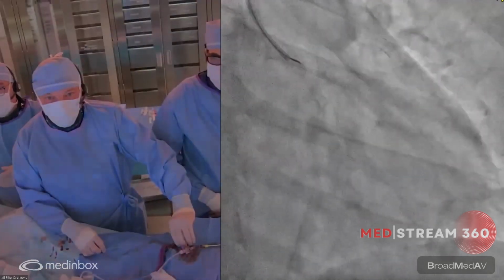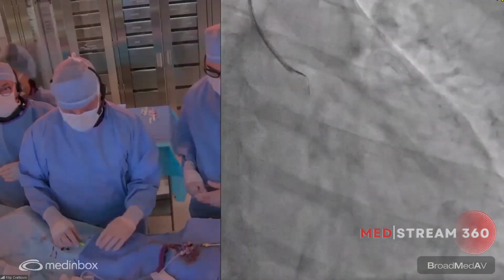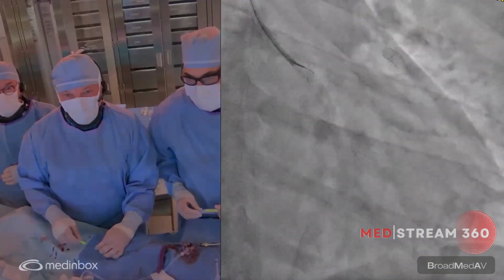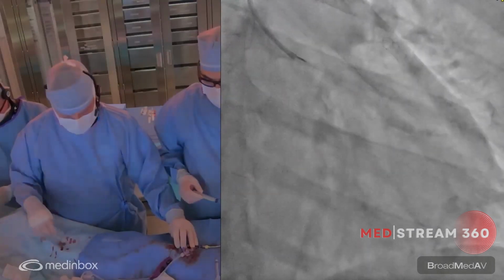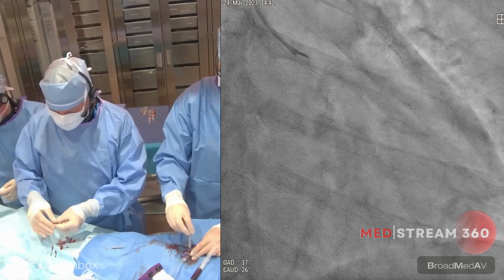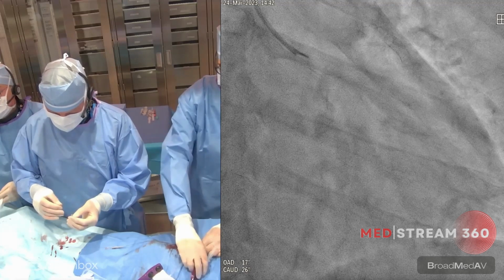Push it in on the side, yeah. So sometimes it helps, but now the angle is, well, I think that's good with the wire. The pushability. The other thing is you could consider looking at the spider to see also the angulation. But I think in this view, you saw well where to go. And this is where you need patience to have success.